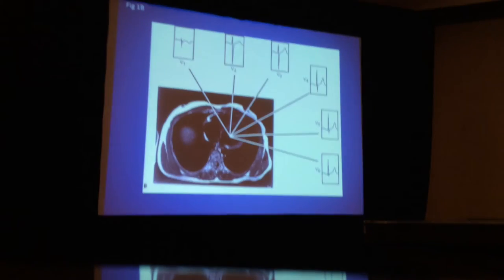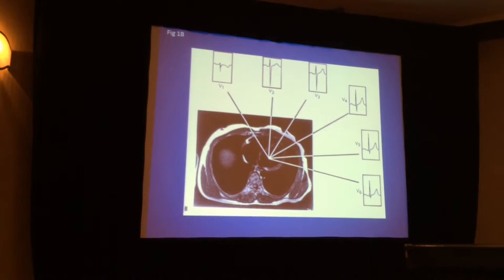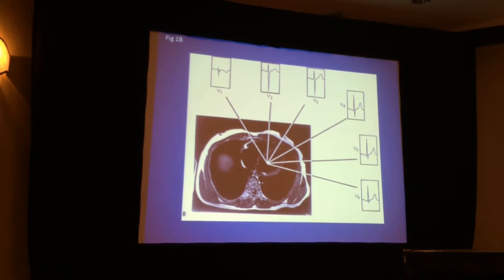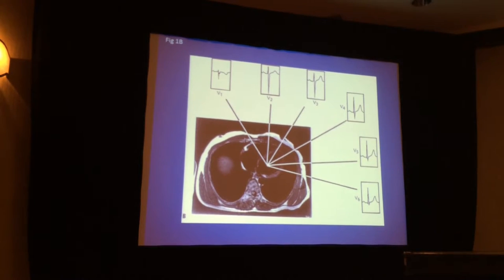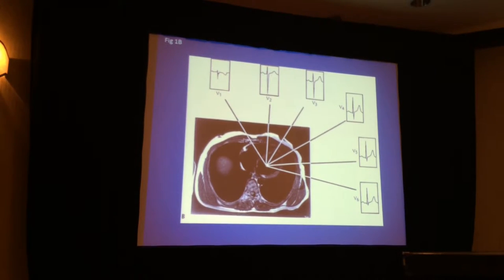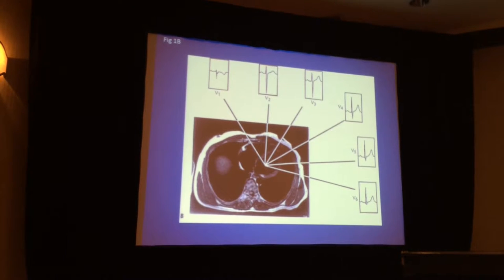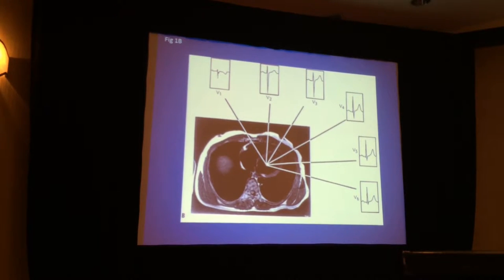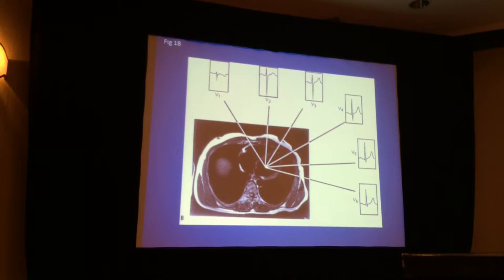Now, as I mentioned, leads are simply views. If one looks at an image such as a magnetic resonance image of a heart in the thorax, looking from below, one can see V1, V2, V3, V4, V5, V6 surface positions. You'll notice that V6, even though it's mid-axillary, is actually a view from slightly behind the middle of the heart. So it really is looking from behind. The positive of V6 is looking from behind, not just straight laterally. In fact, V5 is more clearly similar to a lateral view.